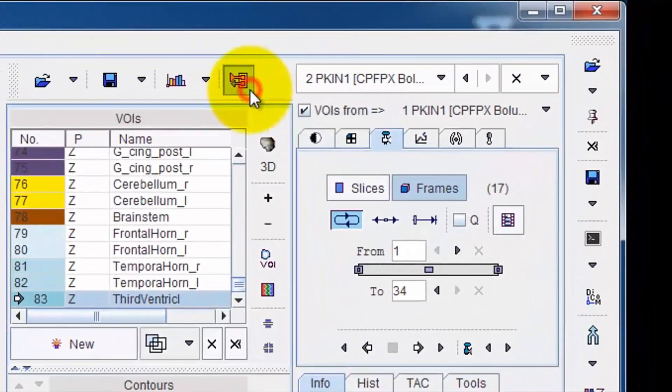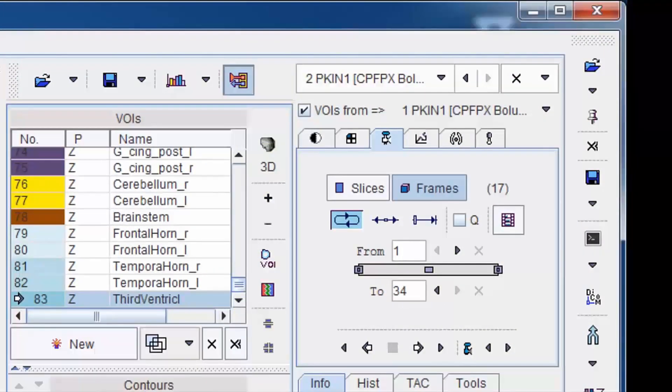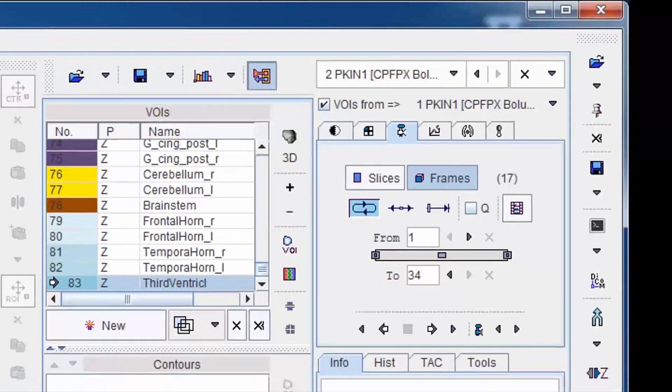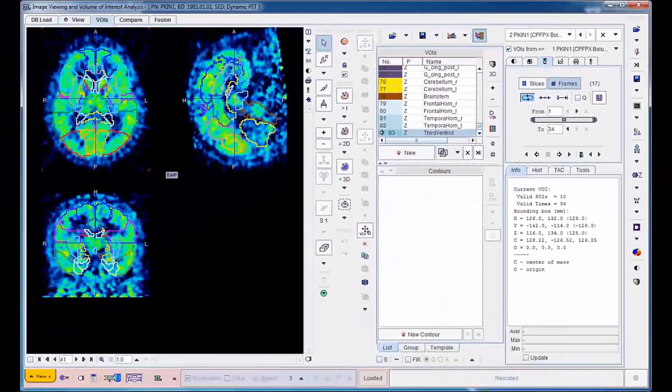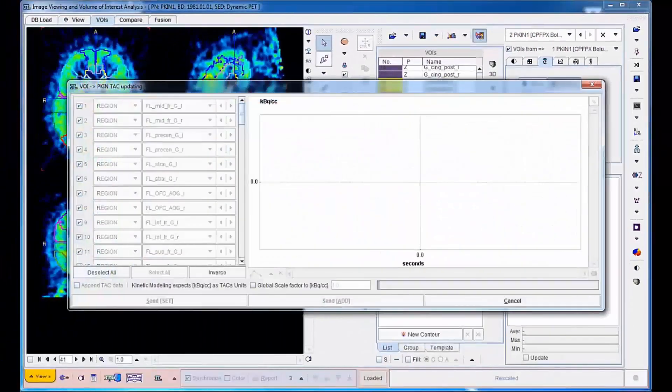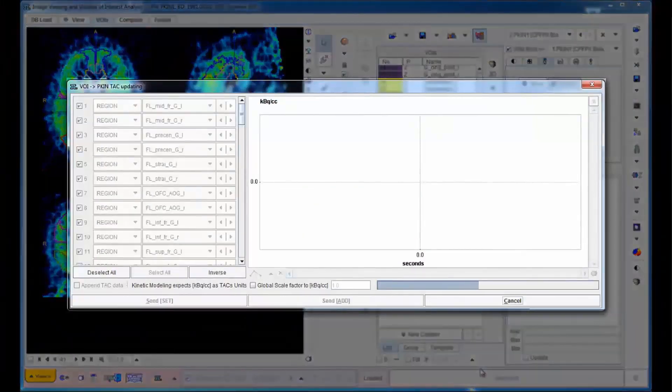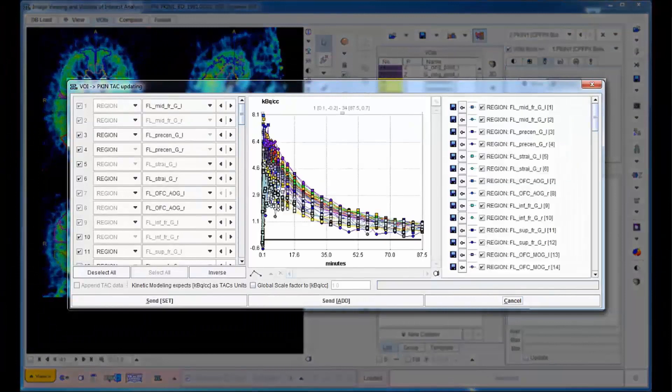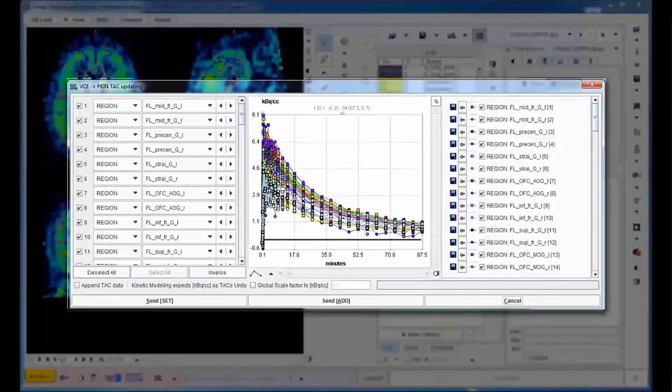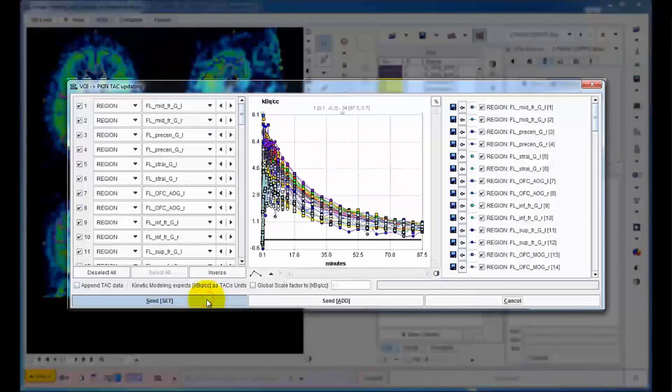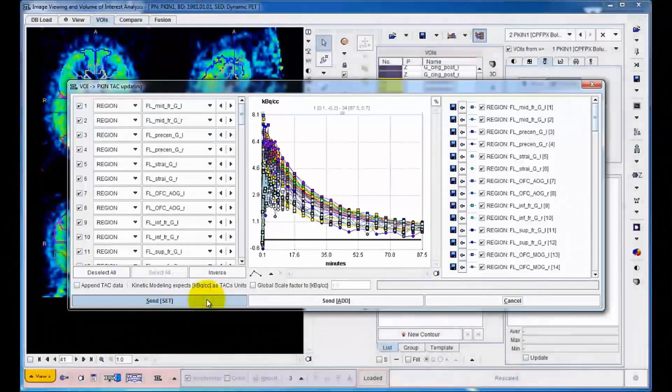As a final step, averaging of the PET uptake in all brain VOIs is performed. The resulting 83 time activity curves are shown in a dialog window. They can be transferred to the PMOD Kinetic Modeling Tool for the regional quantification of brain function with a single button click.